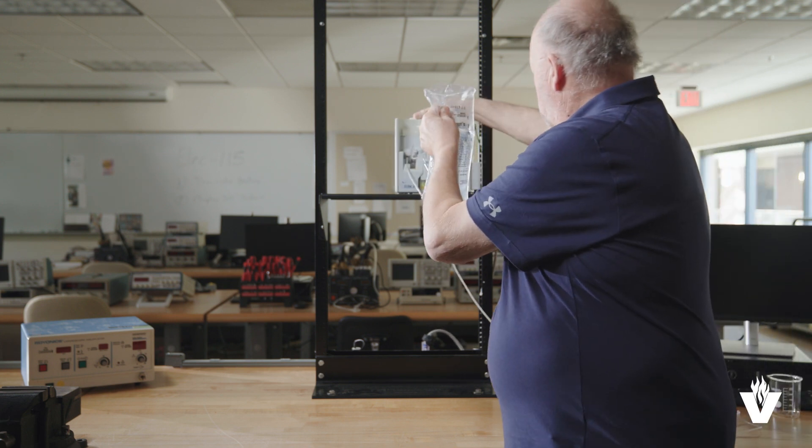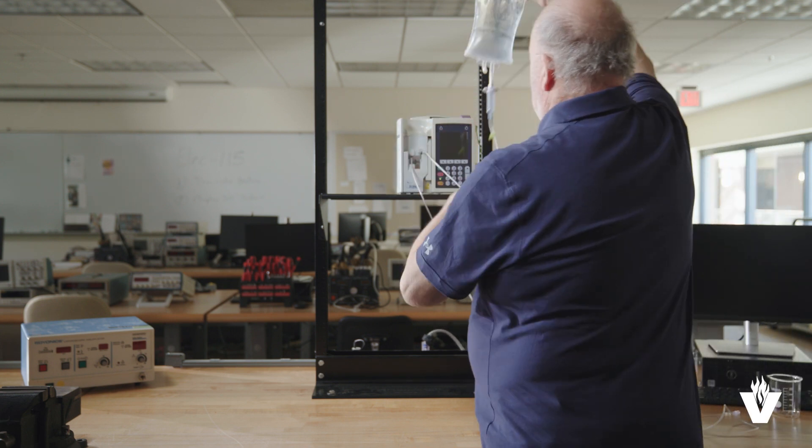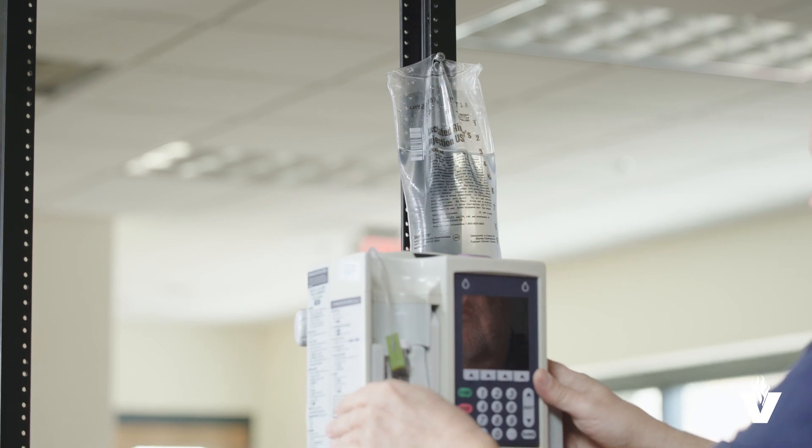First, assemble the station as shown here. Then, hang liquid bags high above the IV pumps.